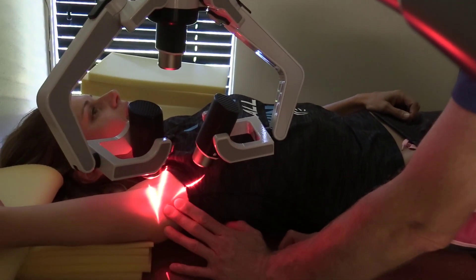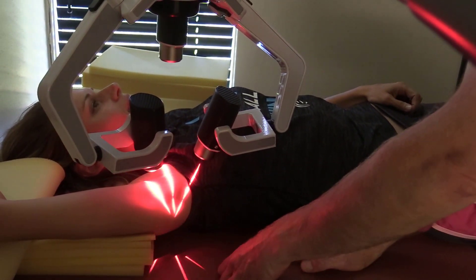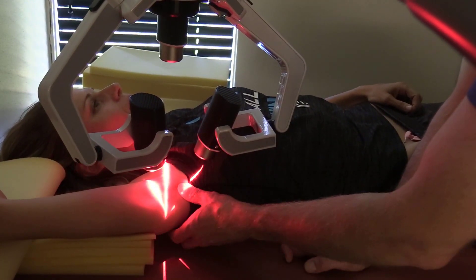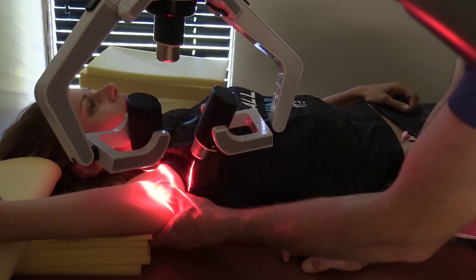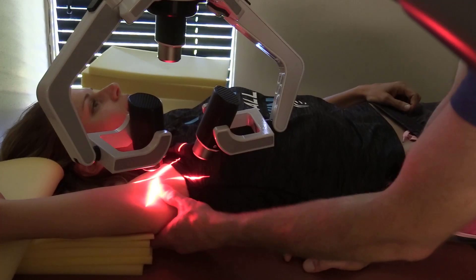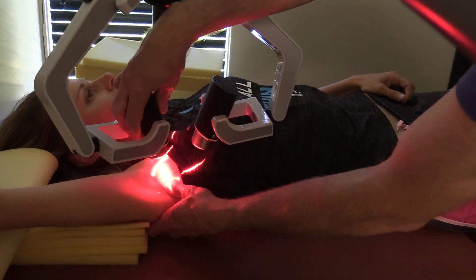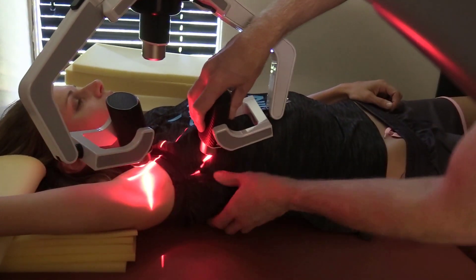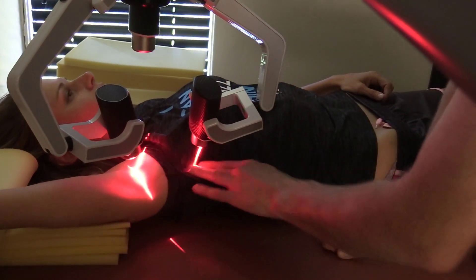If you don't have a slight stretch, it's harder to feel the problems. If she brought her arm down and I felt up here, everything would feel just fine, even if I brought it down just to 90 degrees instead of way up high like this. The slight stretch allows you to evaluate the tissues better. Right now I'm going for a period, and this has already changed in the few minutes it's been up there. So I'm just going to shift this a little bit down there — that's all you do, just move these around based on the different areas you feel.